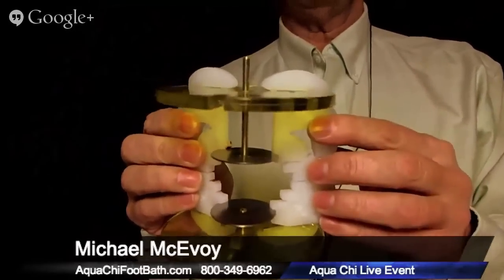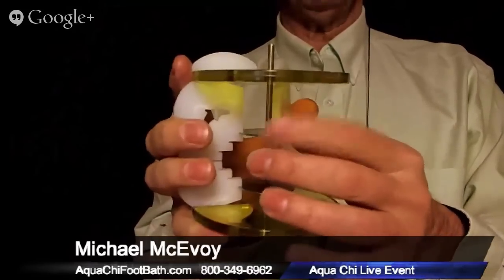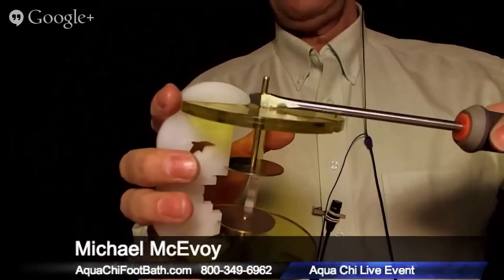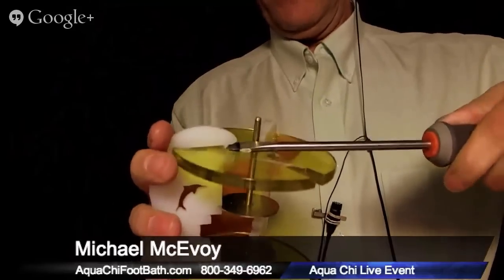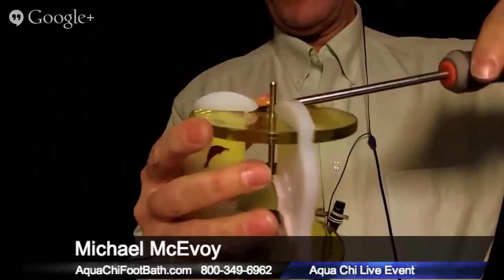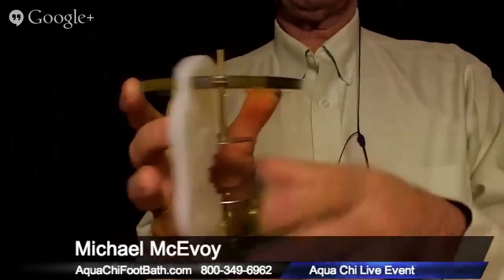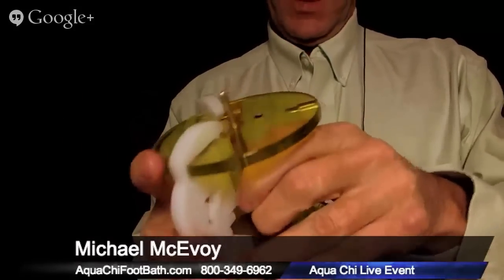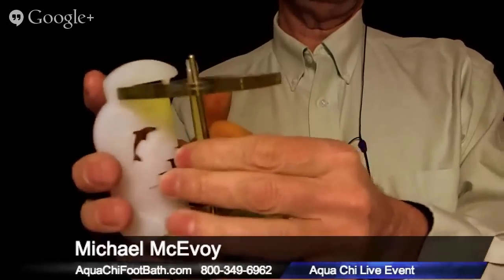The first thing I'm going to do when removing a post set is take the top part of these white legs and just get them over the lip so I can get at that post a little easier. I'm just lifting this white plastic over the lip, and that gives me access to easily remove this post.